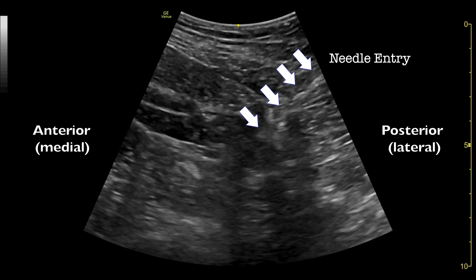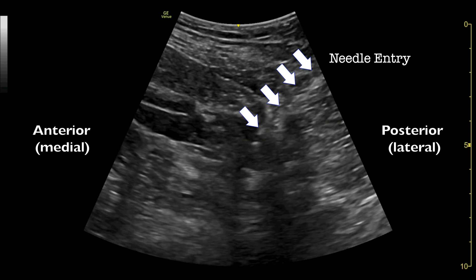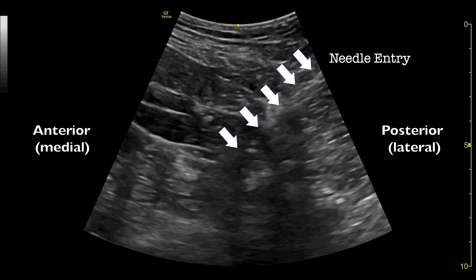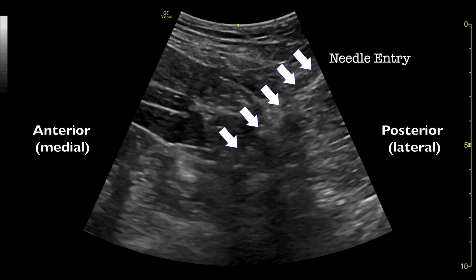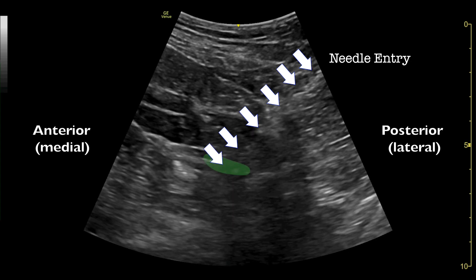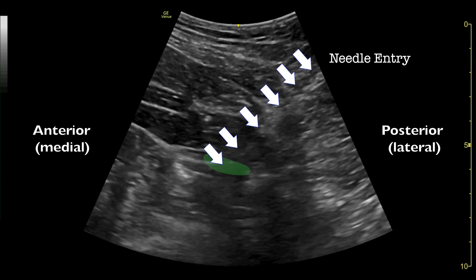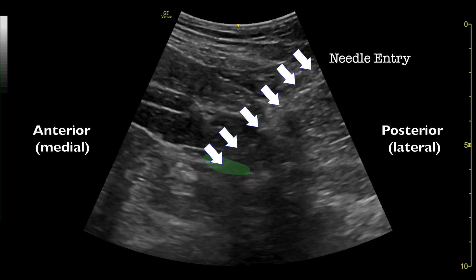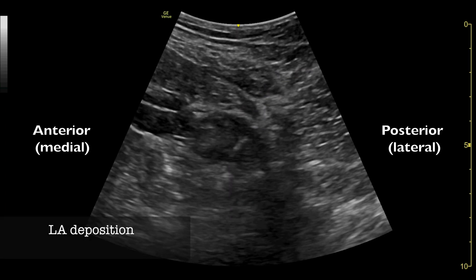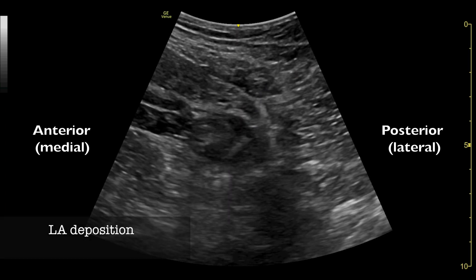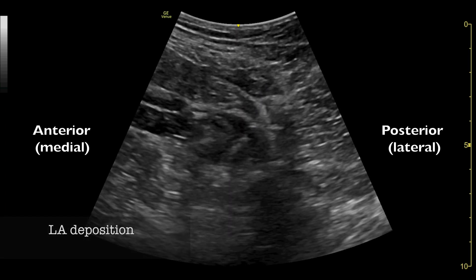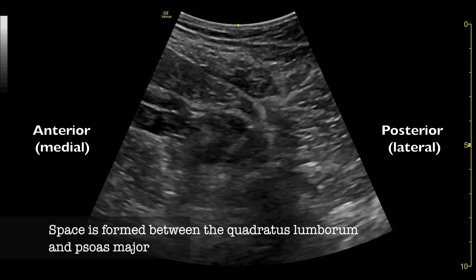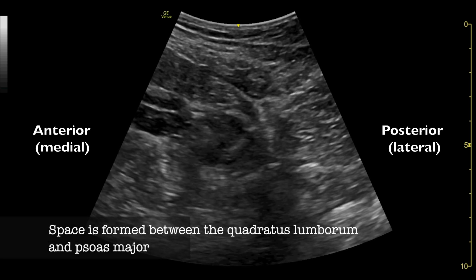The target area for local anesthetic deposition is the fascial plane between the quadratus lumborum and the psoas major muscle. After negative blood aspiration, local anesthetic is injected while observing a space opening up between the quadratus lumborum and psoas.